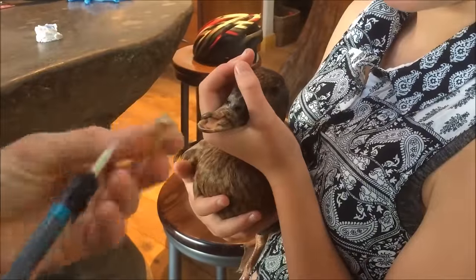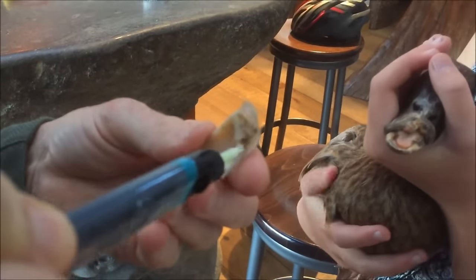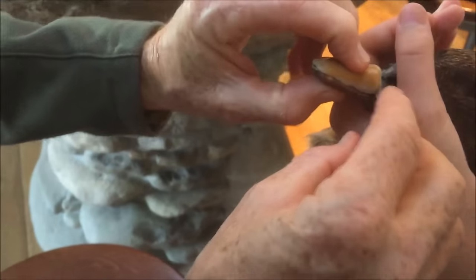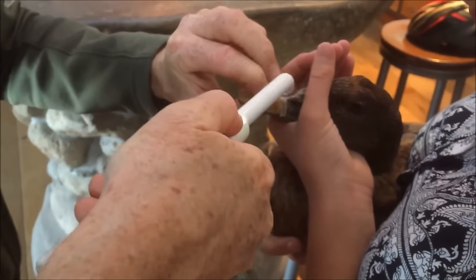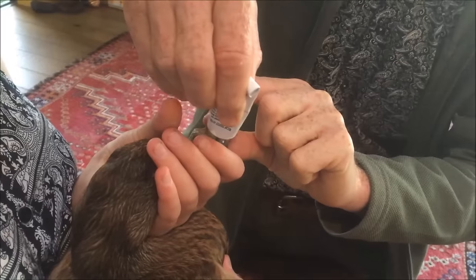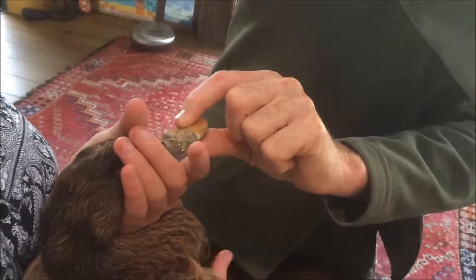So now we've got the beak and we're going to put some cement in it. This is a special dental crown cement — it's light cured — and we'll put this adhesive in here. I've got to get it in the right place and push it on, make sure the beak is in the right place. We'll put a bright light on it which makes it set, then put a bit more on to give extra strength. This is good stuff called triad gel from Dentsply — all sorts of things you can do with this stuff, including beaks.